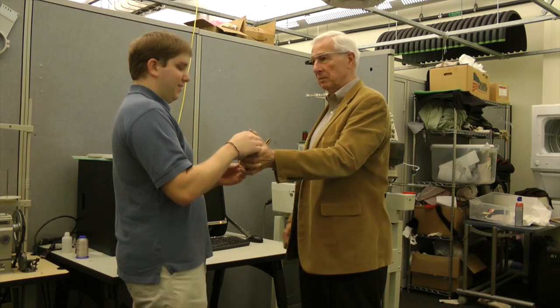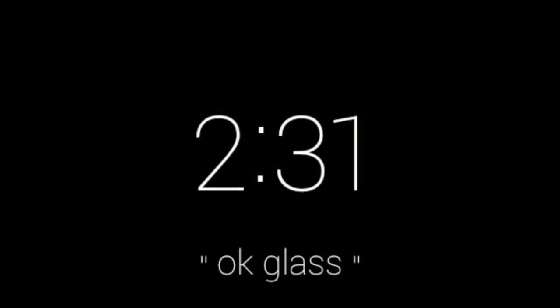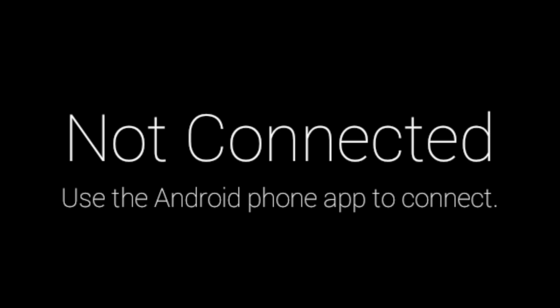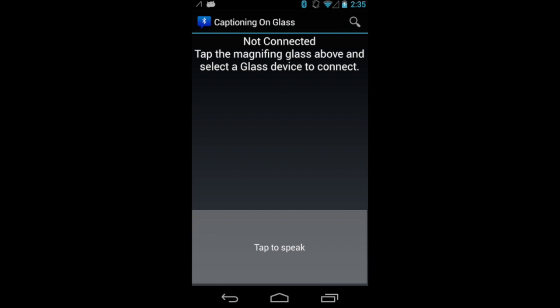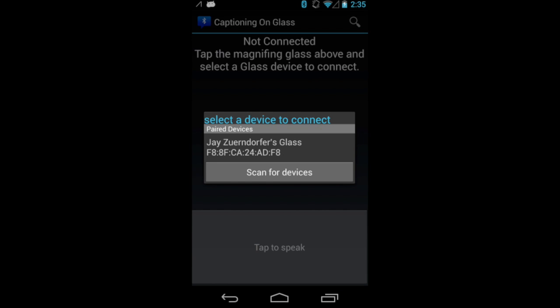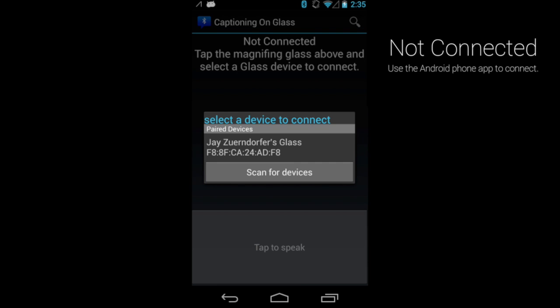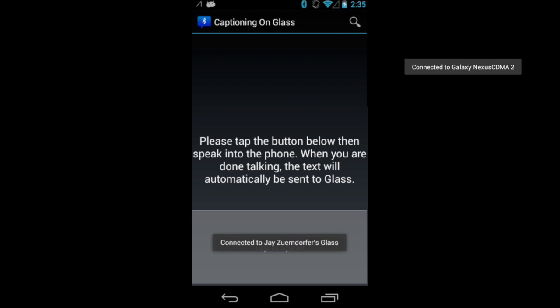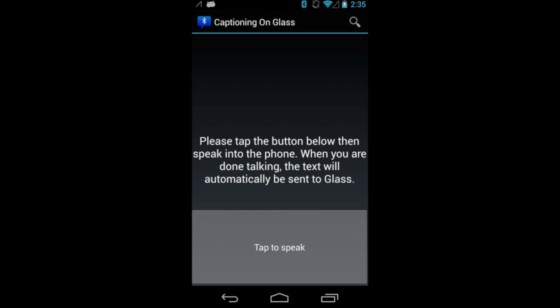He hands the phone over to the student, who will talk into it for the conversation. Okay Glass, start captioning. The Android app provides instructions on screen for connecting to the Glass device. Both devices show that a connection has been established, and instructions are shown for the user to begin talking.